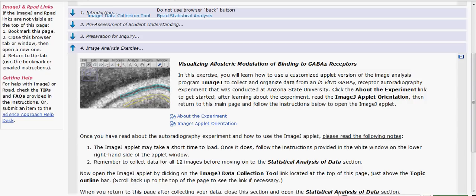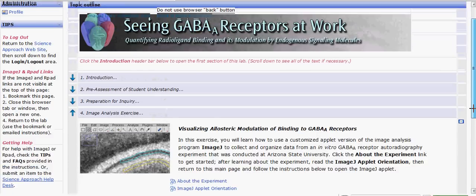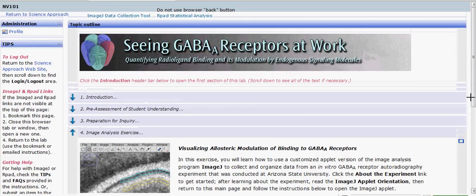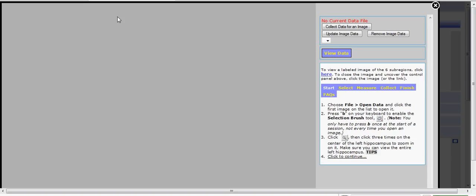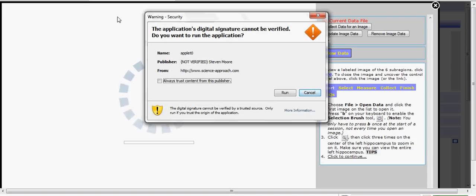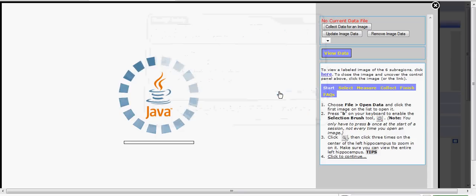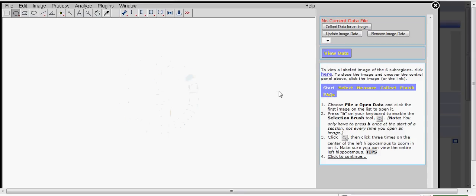The first step is to scroll back to the top of the page and find the link to the ImageJ data collection tool. When you click on that, the ImageJ applet will begin to load.